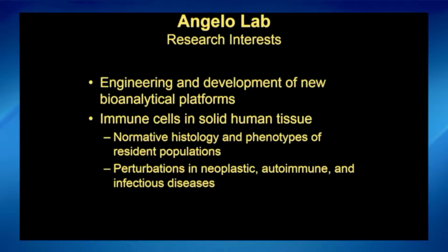Thanks for having me. My lab has been working on developing a multiplexed imaging technology that utilizes antibodies for a multiplexed IHC assay where each of the antibodies is labeled with a mass tag instead of a fluorophore or a chromogen. That technique is called multiplex ion beam imaging.